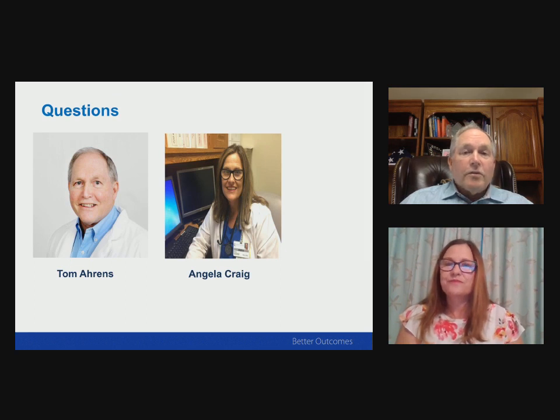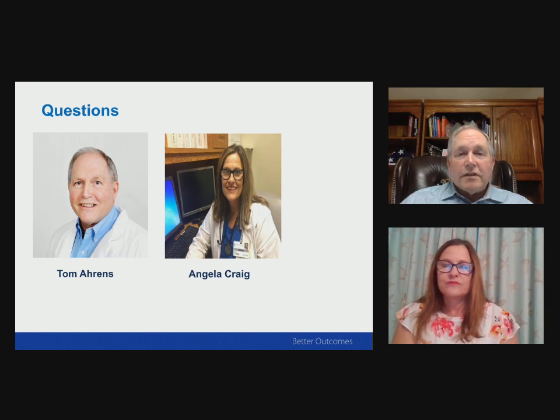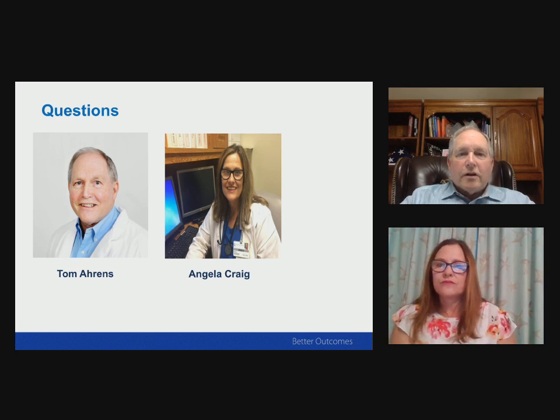If I were to want to do a reading like I showed on myself, or on anyone in a clinic, they're not on a ventilator, then we're obviously going to be using a side stream analyzer, because that's what the handheld devices are. But they both work. I would not worry about that.